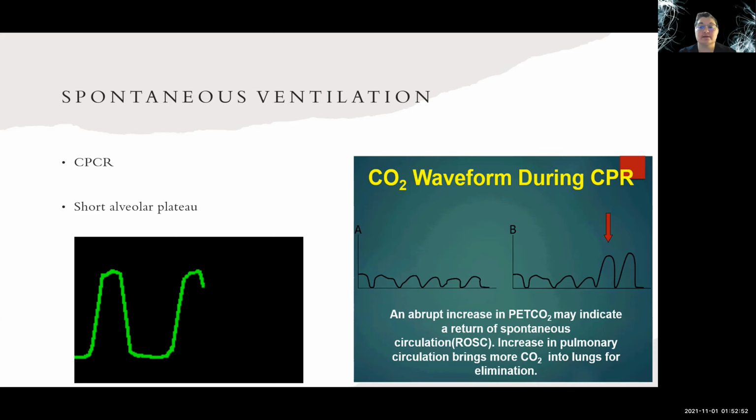Well, once we get them where they're breathing on their own, then we're going to start seeing regular height, kind of like the image on the left, or the end of the image on the image B, where that red arrow is. Baseline still is zero, but the shape is going to be different.